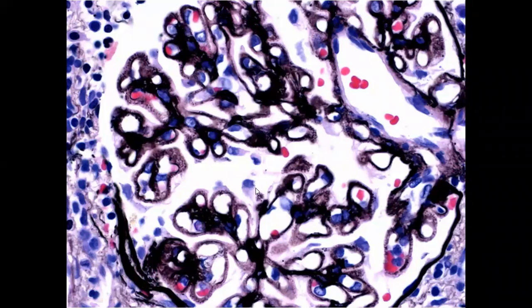Here also you can see a podocyte which is quite prominent. These are the RBCs. This is a hilum, so you can see RBCs in the hilum. You can see RBC within the glomerular capillary loop. And these are the lifted up podocytes which you can appreciate. You can see a lifted up podocyte here. This is a lifted up podocyte. This is the Bowman's capsule.